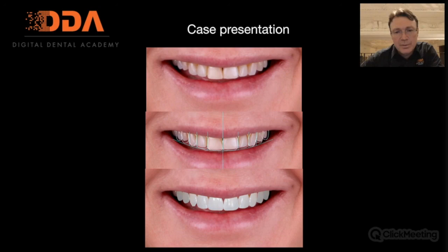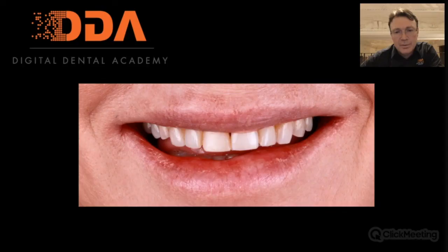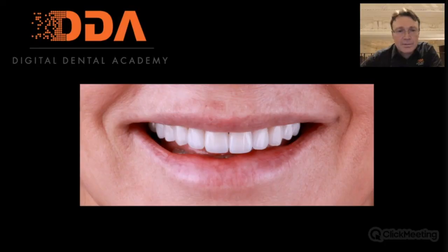They're constantly developing it. So from that pre-op situation, we knew, okay, we're going to have to make the teeth a little bit longer, to basically add more length to the teeth where the patient has ground them away and flattened the occlusal surfaces and things like that. And then this is the final result.